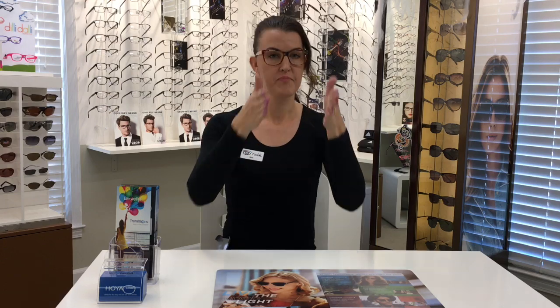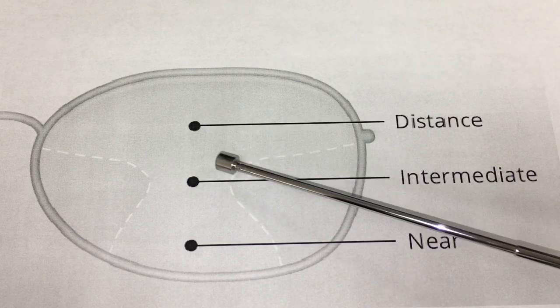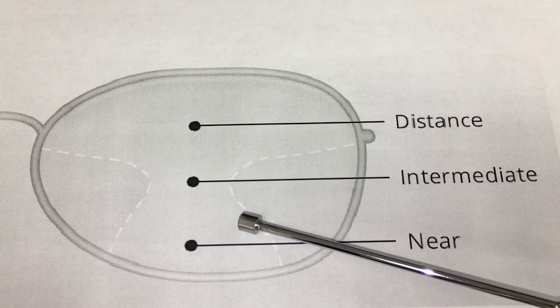Then we have the intermediate, or what most people use it for: the computer distance. That part is a little tricky — it's the narrowest field in the lens. A progressive lens is kind of designed like an hourglass. In this hourglass, perfect clarity is big towards the top for distance viewing, a little narrower at the computer distance, and a little wider down at reading. You should be able to comfortably read side to side on a piece of paper, but for computer distance it's important to face your screen straight on and do a little tilt until you find the sweet spot.